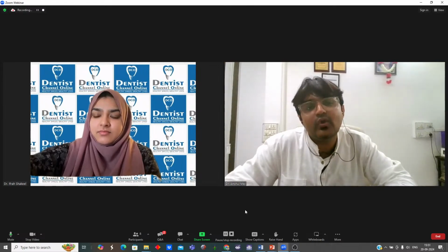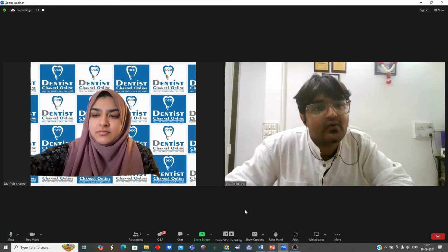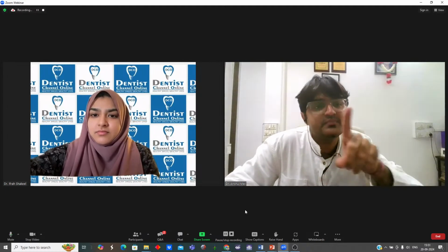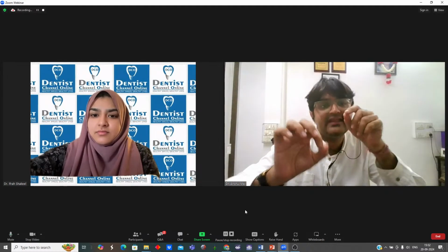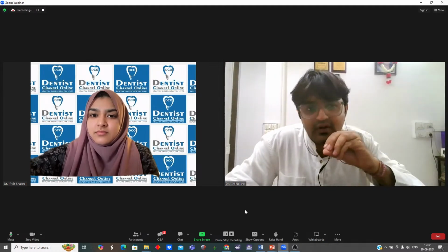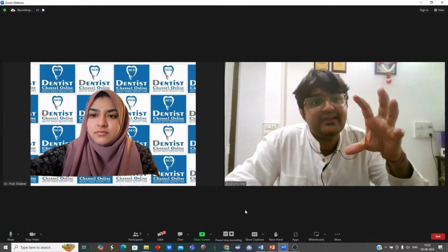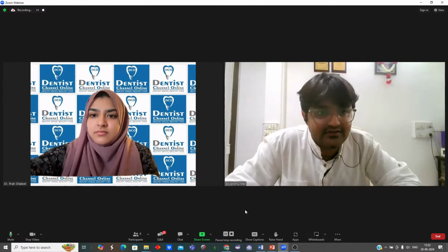Now, printing has a problem: you will not get the exact dimension of the inside of your sleeve area. So what can you do? You have three options. One option is to do 3D printing and calibrate it, and then the software has a provision to modify your file. For example, if your sleeve is 0.5 mm smaller than required, you can create the hole 0.5 mm wider inside the software. So after printing you will get the exact hole.